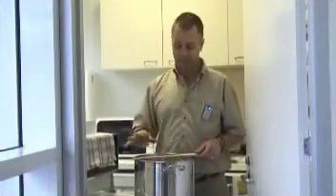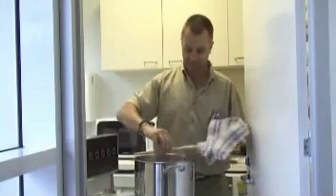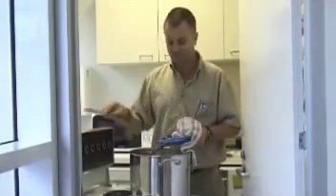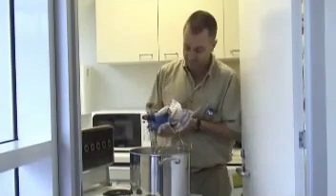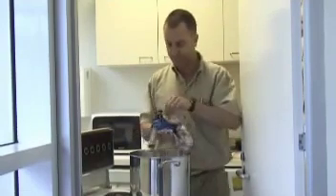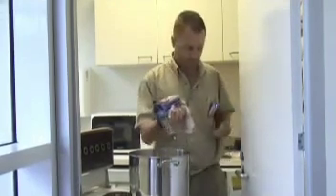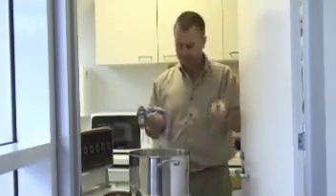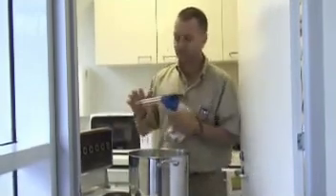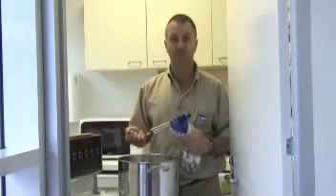Okay, this instrument has been in the water here. It's boiled for about 20 minutes. So when you remove the instrument, remember it's going to be very hot. So I've got a dry cloth, so I pick it up, remove the spoon or the stick, whichever you've got across the pot there, and just carefully, I've expelled all the water. I can then take the wire, in this case, off the applicator. That I have there. So that's now ready. That applicator's been boiled. The needles are in here, so I can just drain the water out and get the needles out of the pot, and then the whole instrument's ready to take and use.